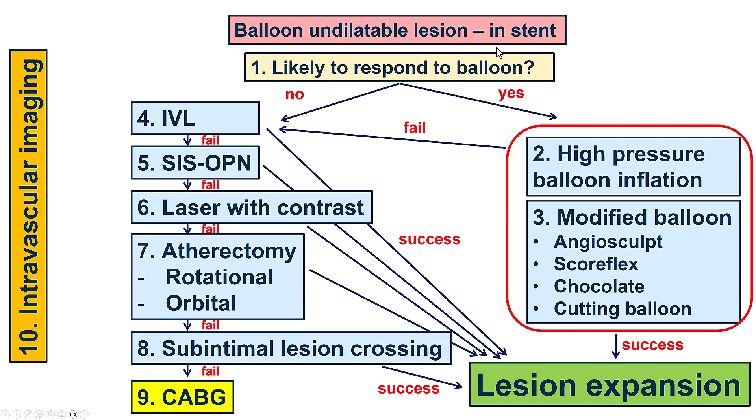So what to do? This is a balloon-undilated lesion within a previous stent, and this is the current algorithm we use. The options are to do high-pressure balloon inflations with standard non-compliant or plaque modification balloons like the Angiosculpt, Scoreflex, chocolate, or a cutting balloon — though not high-pressure with a cutting balloon. If that didn't work, which it didn't in our case, then we typically use as first-line intravascular lithotripsy.